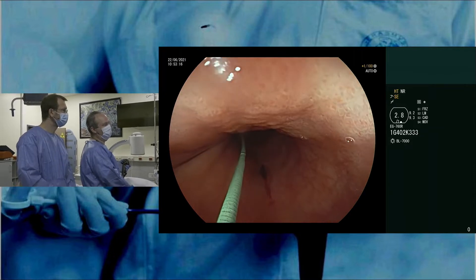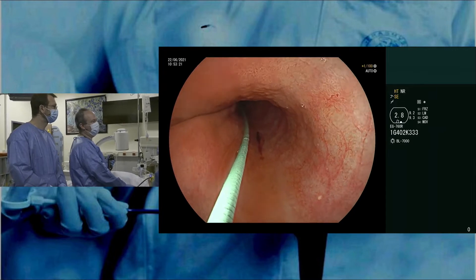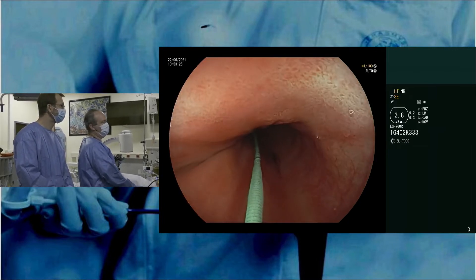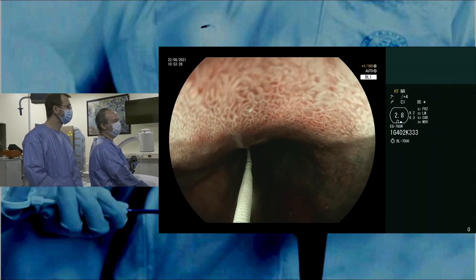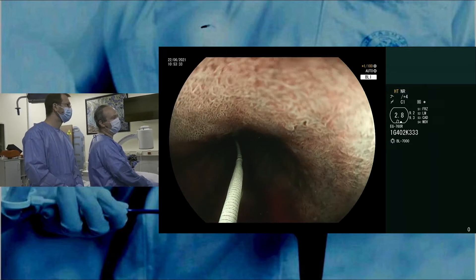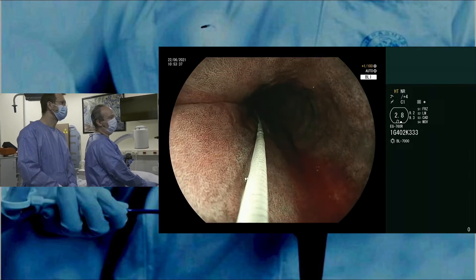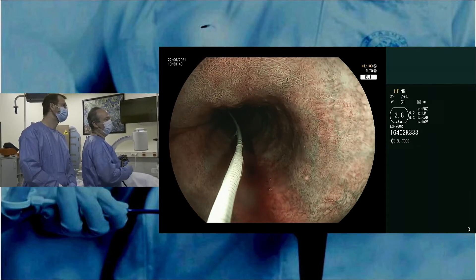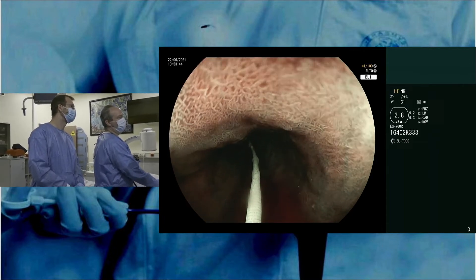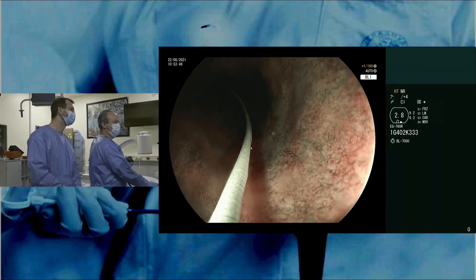I think there is still dysplasia here but it's quite flat. With these high-definition endoscopes you get a really nice view, and if we switch to the BLI image, you can see there is some variability in the pit pattern and the vascular pattern — for instance, here at one o'clock. It's actually more uniform; it's not like a real area that you can delineate like a typical lesion, but especially here at the 12 o'clock position the pit pattern is a bit different from what we see at six o'clock.